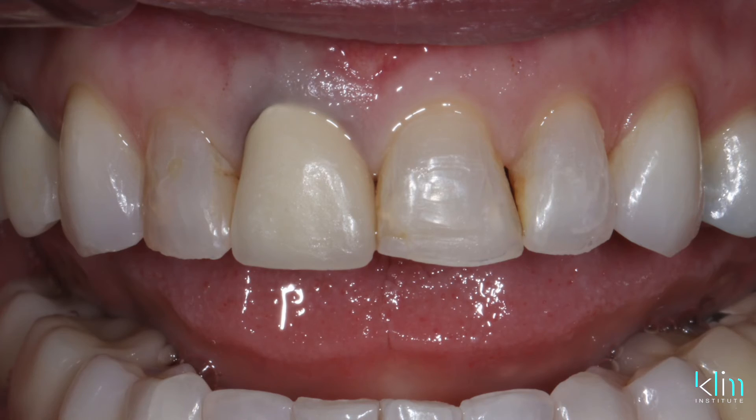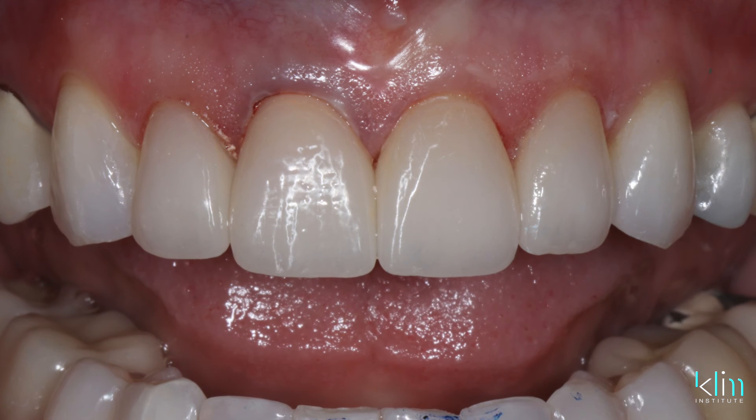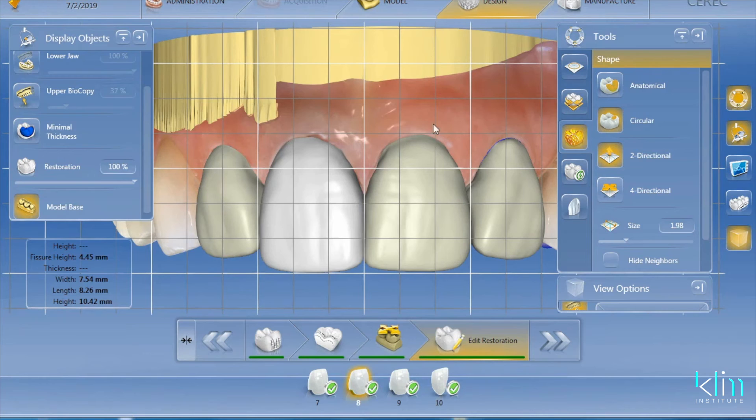It's almost a biomimetic concept — I can mask out that dark root better than if I had placed ceramic down there, because it breaks up the fiber optic effect in the e.max. E.max has a fiber optic effect, so if you put an opaker down on the margin — a different material that separates that effect yet is bonded to the crown — I know this seems off-label, but I get a better mask. I'll post the picture once the tissues heal and we'll see how the blend is and whether there's visual tension.